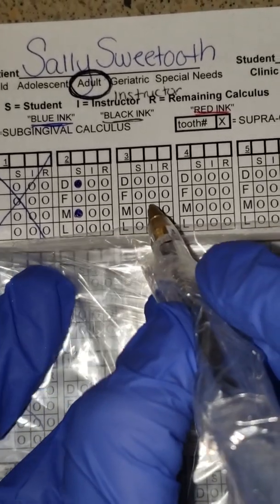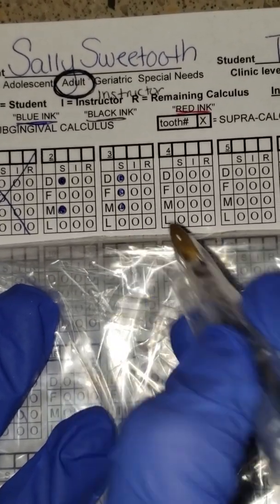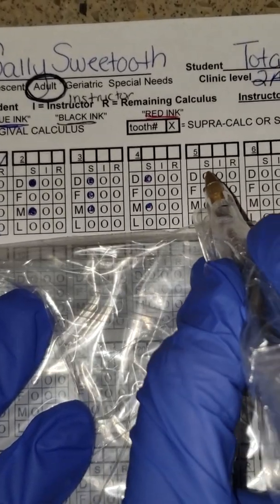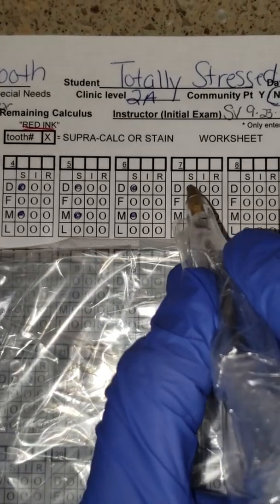Now I go to tooth number 3. I feel it on the distal, the facial, and the mesial. Number 4, I go all the way through the entire mouth using this system.